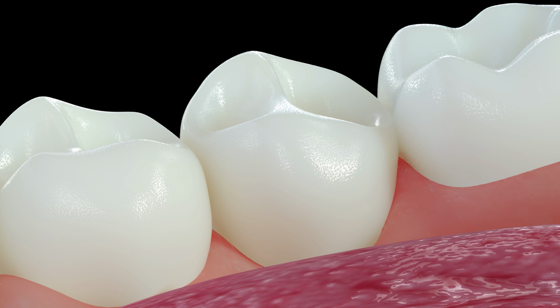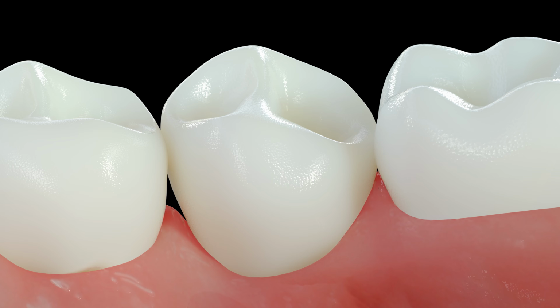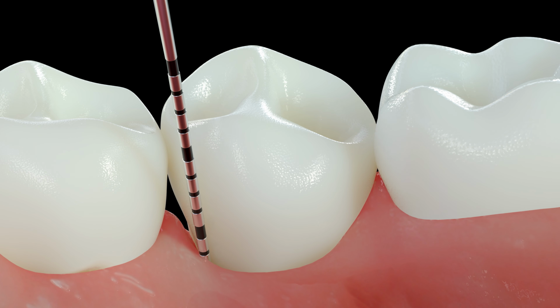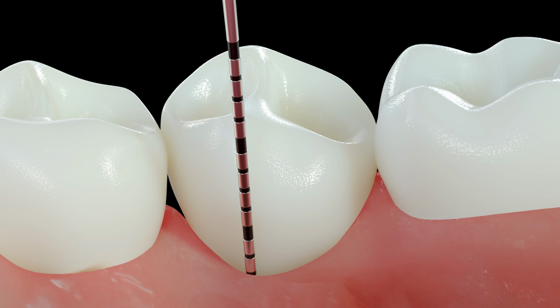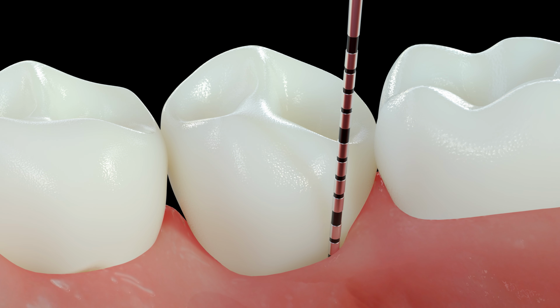Measure the probing depth at 6 sites, including mesial buccal, mid-buccal, distal buccal, distal lingual, mid-lingual, mesial lingual of each tooth, by gently walking the probe from one position to next. Here, the probing depths are recorded as 323 from buccal and 334 from lingual. Ensure to record interproximal probing under the contact area to ensure accuracy, not at the line angle of the tooth.